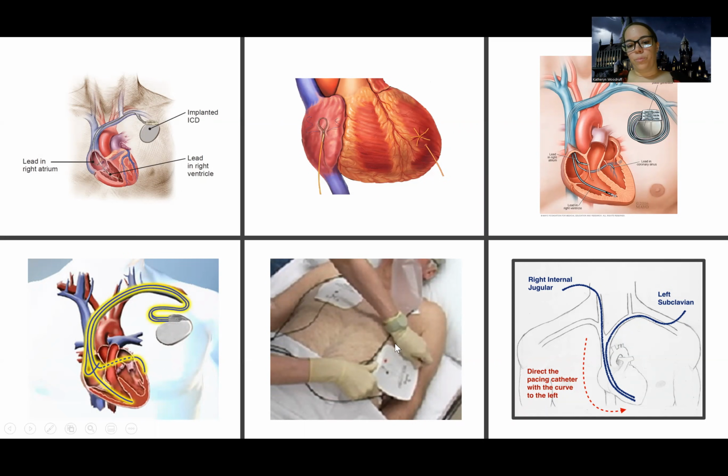So we definitely want to help them out there. Now, some of these patients are not going to be with it. They may have recently had their heart stop or something, but keep in mind, generally we sedate patients if we're going to transcutaneously pace them. This is all temporary.